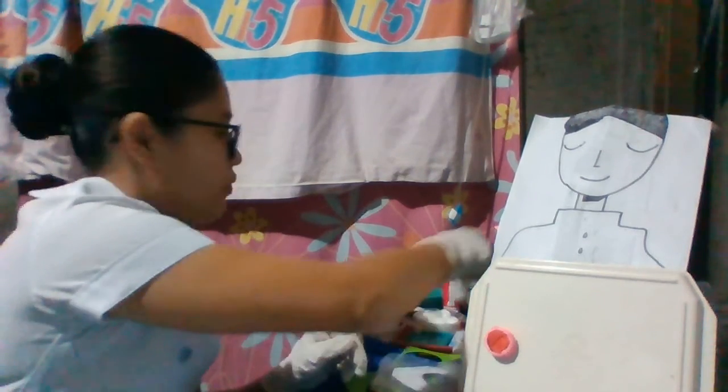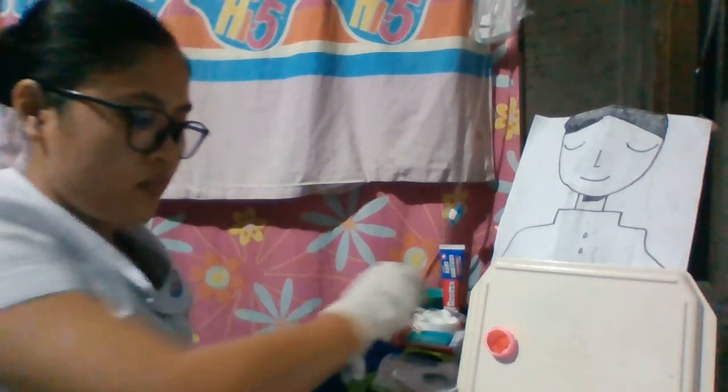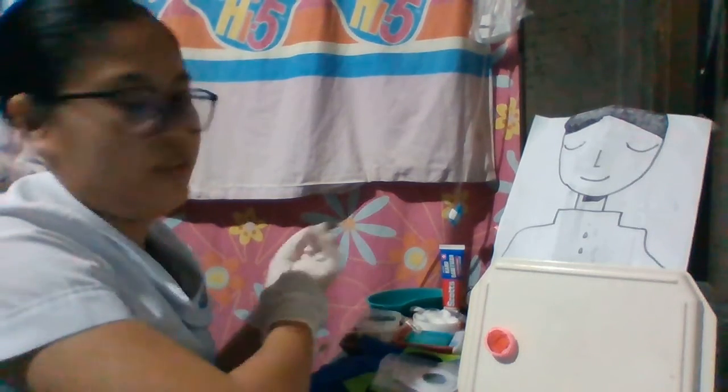Then next, rinse the soap thoroughly and blot dry.